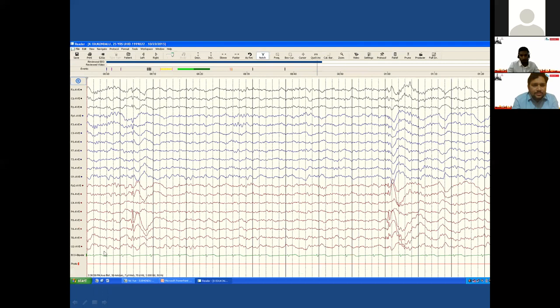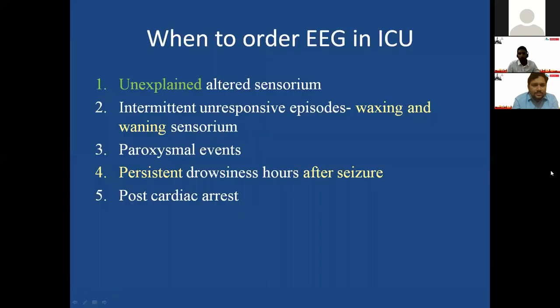In the second example, the discharge is seen only in one particular area — F8 or T4 region — with a sharp spike followed by a wave. Since 8 is right-sided, F8 is anterior temporal and T4 is temporal, this shows spike-and-wave focal discharges in the right temporal region, indicating some abnormality in the brain in that region. This is how we identify focal epileptiform discharges.